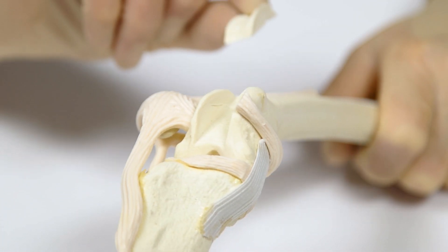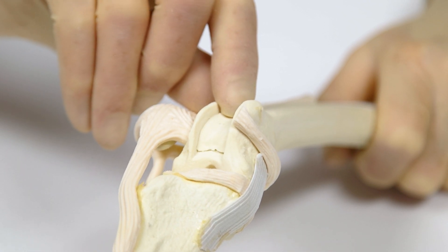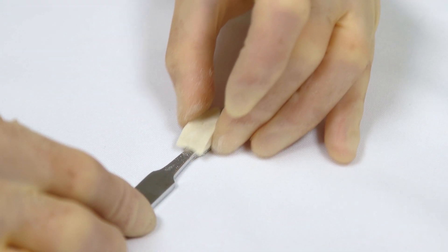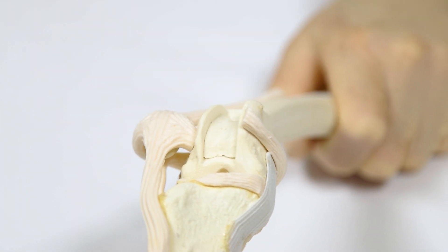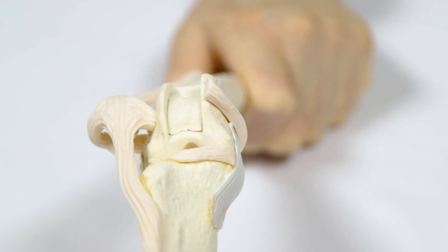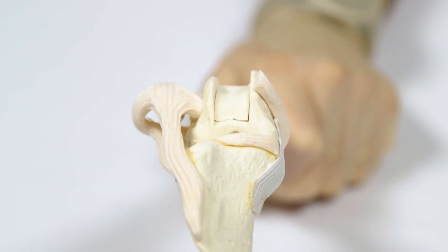The osteochondral block is then repositioned in the graft site. Fit, stability and depth of recession are reviewed and adjustments made as necessary. If the block is loose, pledgets of excised subchondral bone can be used to wedge the block stable between the trochlear ridges and the osteochondral graft.